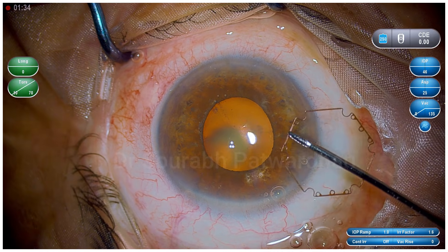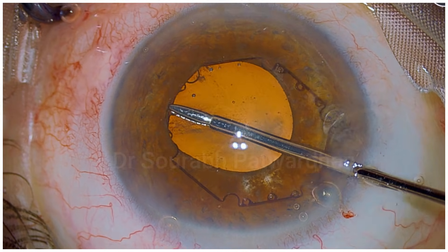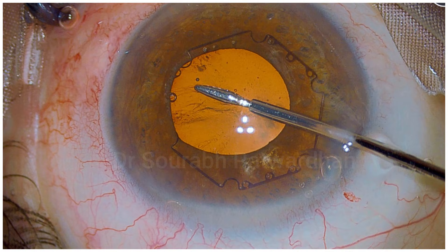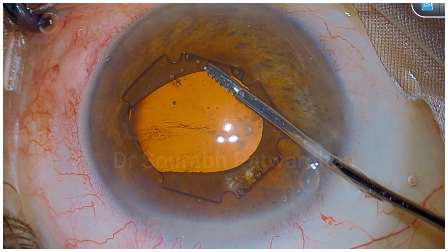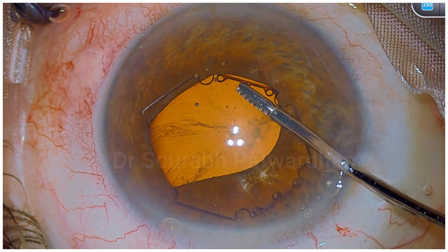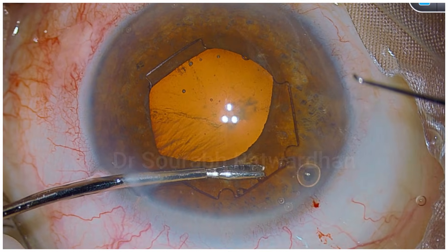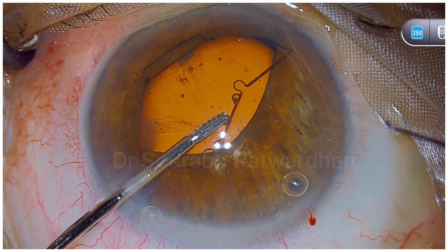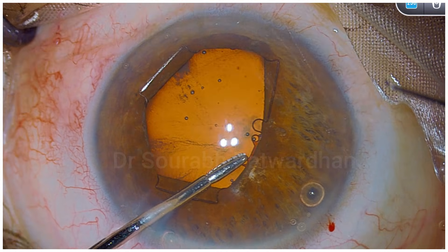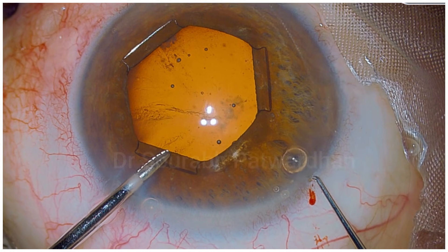This is the Bhex 2.0 — it is thicker and stouter than the previous version. You can see that I have inserted it in the anterior chamber. While inserting, make sure that alternate flanges are above the iris and hook the iris as you insert on both sides. I am holding the eyelet at the center and the other two eyelets go under the iris. I have inserted the first two flanges from the main incision and the third flange I am inserting sub-incisionally using the left side incision, watching carefully that the flanges go under the iris.